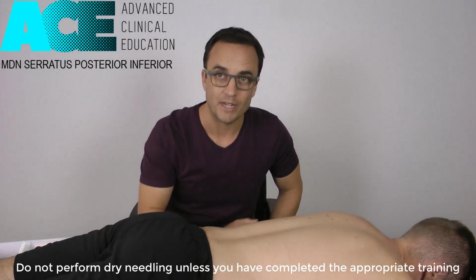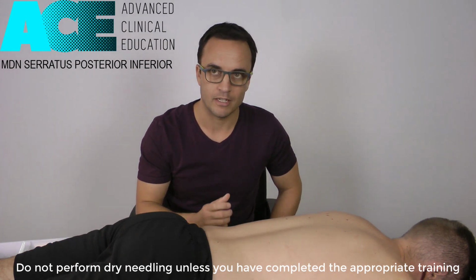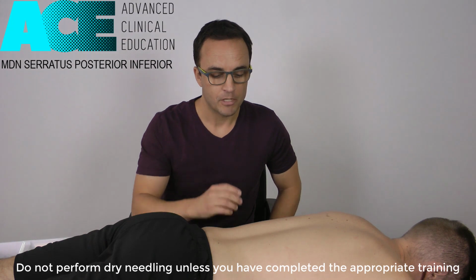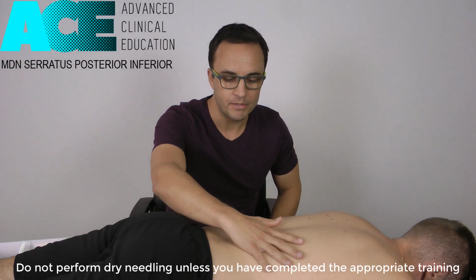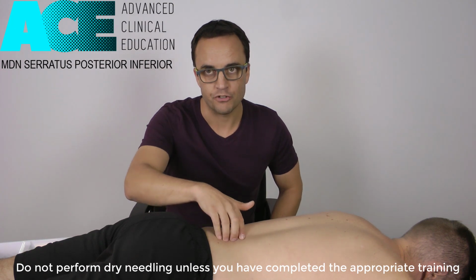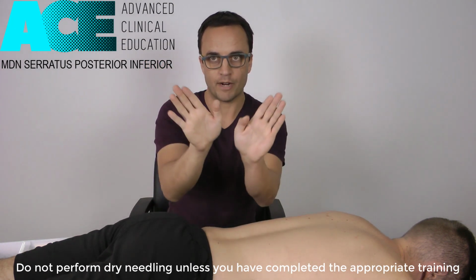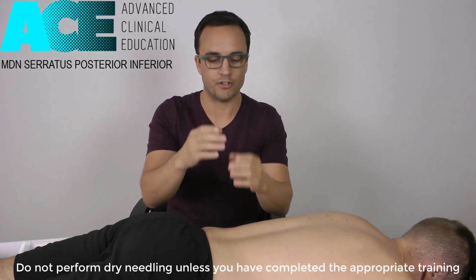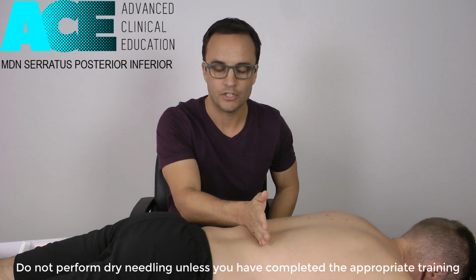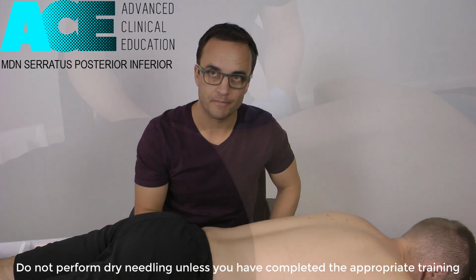It's also involved in respiration, so it's a multifaceted kind of muscle, this one. Very important to maintain its healthy functioning. So this muscle extends off of the lower ribs and then comes down and attaches to the spinous processes of the lumbar spine. So on each side of the lower back, it kind of creates a V. And you can imagine how that would restrict rotation when somebody tries to move through that thoracolumbar junction. So we're going to now take a closer look at how we would needle this muscle.